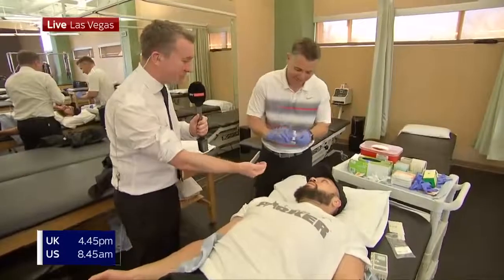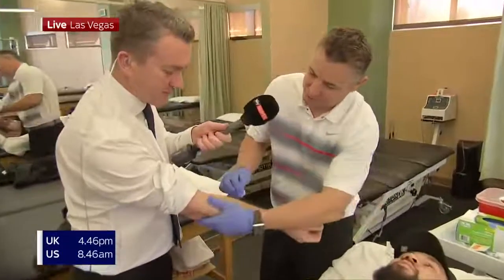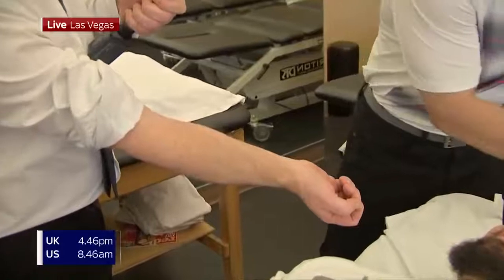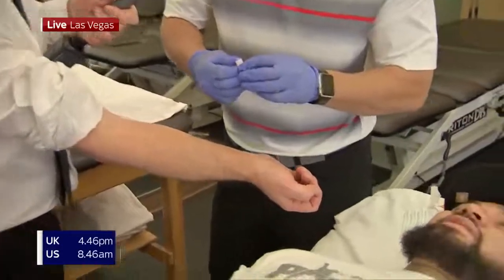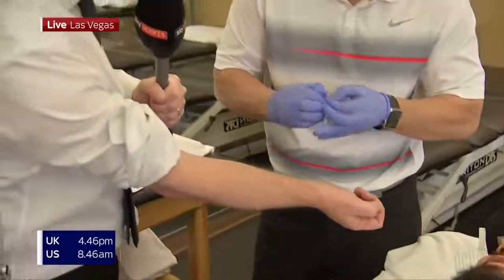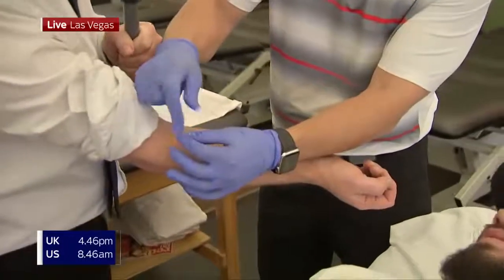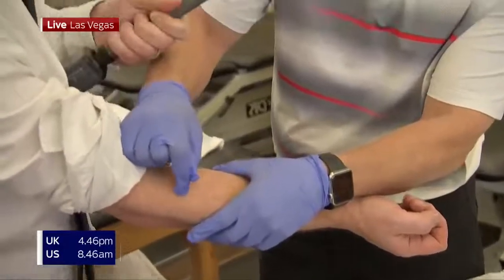Yeah, you talk us through it. What exactly is happening when this happens? So normally you look for some trigger points in the muscles, and we use the alcohol to keep it all sterile. And then what we do is we insert. Yeah, we've got the little ones for you. We won't use the big ones on you. This is a first. This is above and beyond the call. No, so you just come here, tap it in. Is that in? And then it's in, and you can see, kind of punt around.